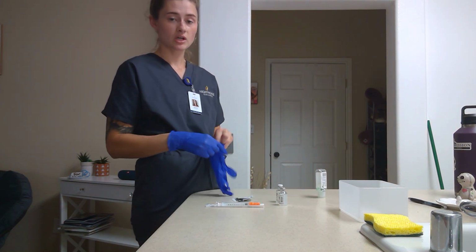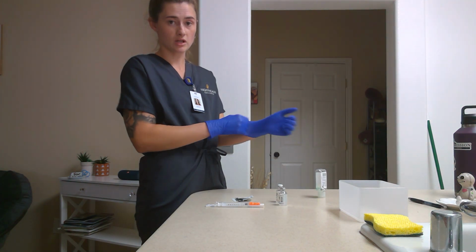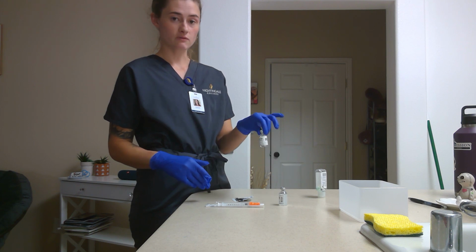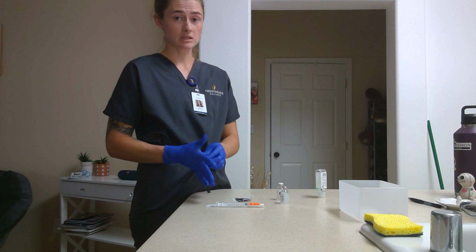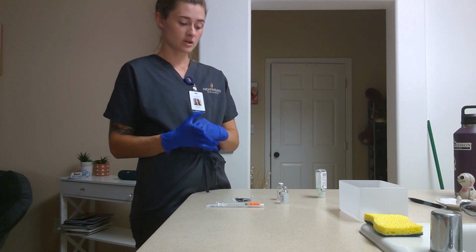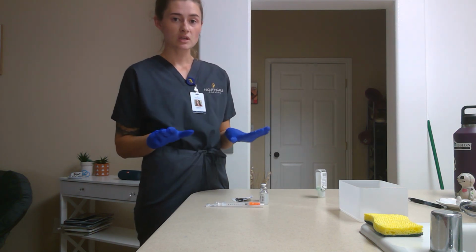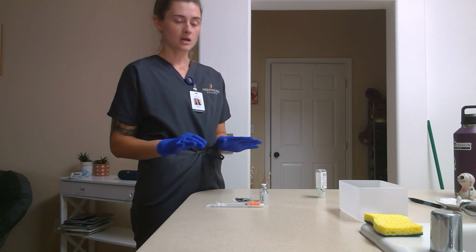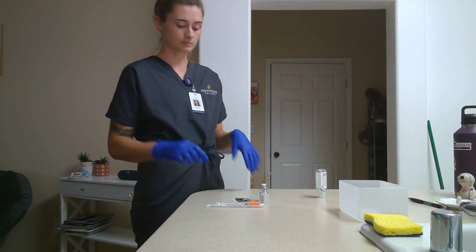Again, I'm going to be checking the electronic health record because I want to make sure that I'm giving the right amount of medication. So I will be giving today 4 units of regular insulin and 8 units of NPH. We're going to be mixing them today. So there's a couple steps that we need to go through that are really important. So first thing is that I need to clean the tops of the vials, and then I'm going to explain what the steps are and procedures for mixing.